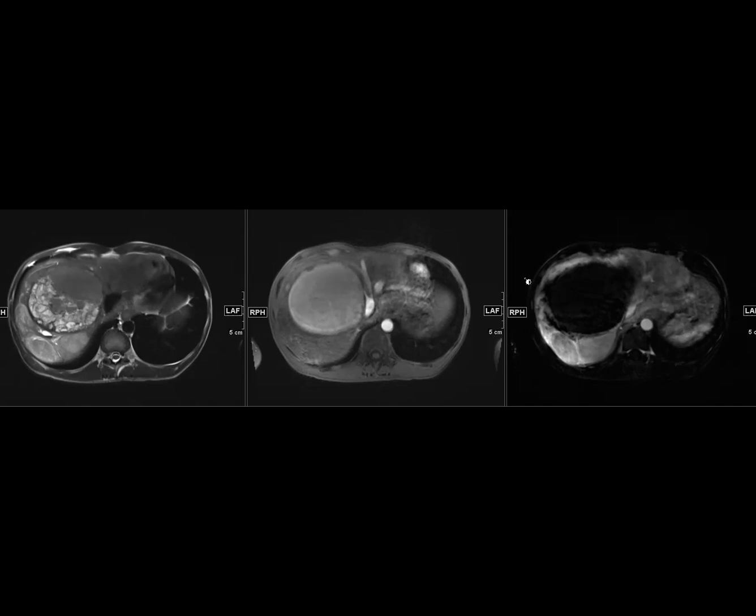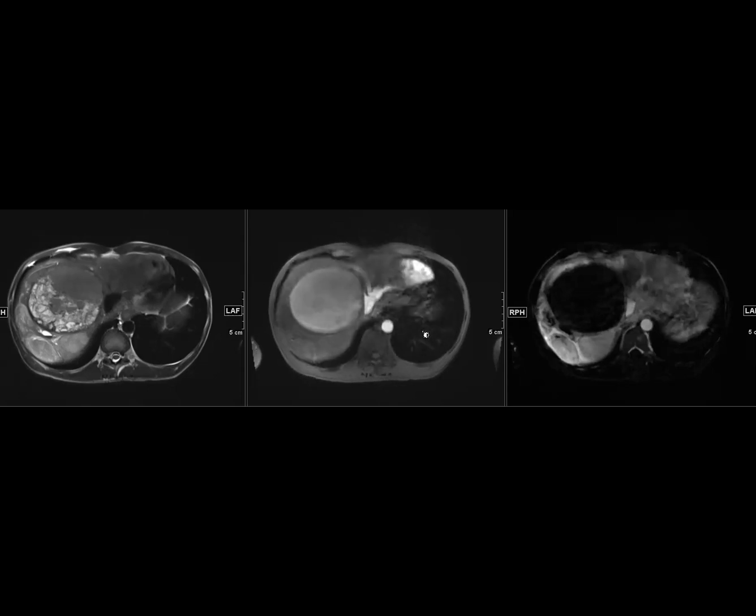So a couple of teaching points here. One is obvious: things like this usually need biopsy. But this is an example of how, without cirrhosis, the LI-RADS 5 criteria lose their specificity, because you do need substantial pre-test probability to maintain that high post-test probability. So this patient, even though he's an alcoholic, doesn't have cirrhosis, so he's allowed to have many other entities aside from HCC. In this case, he had neuroendocrine tumor metastasis. We still have not found the primary. They did a PET, and so far they couldn't find the primary. Moving on.